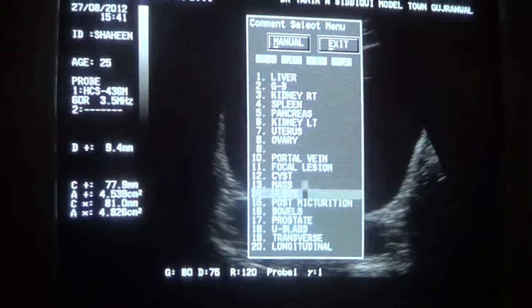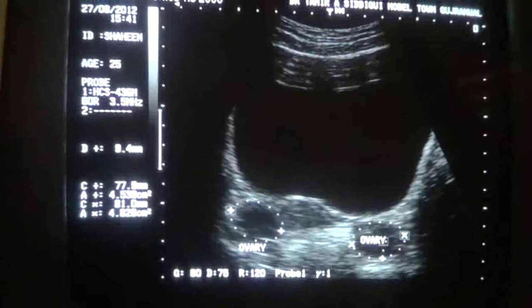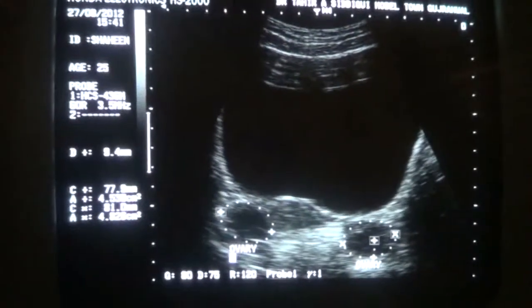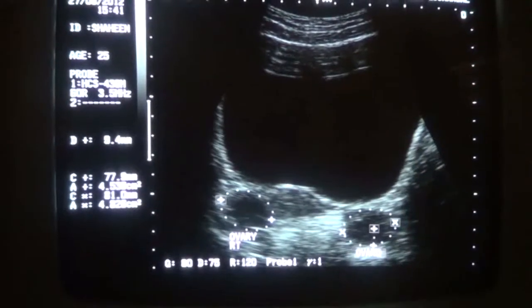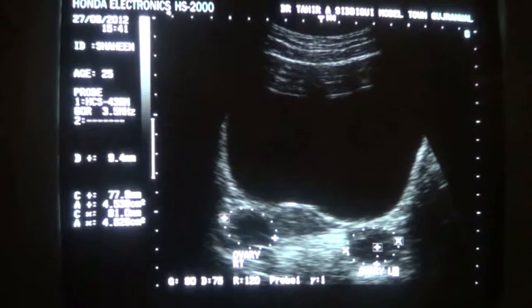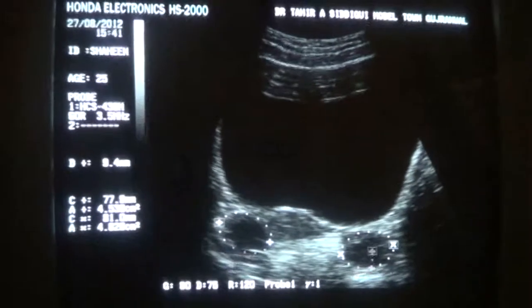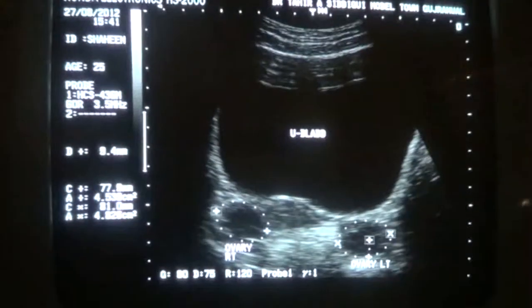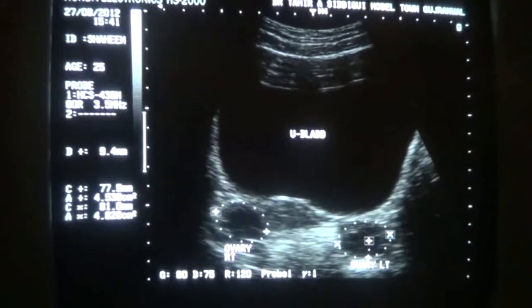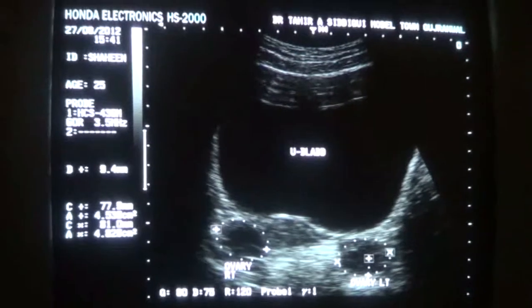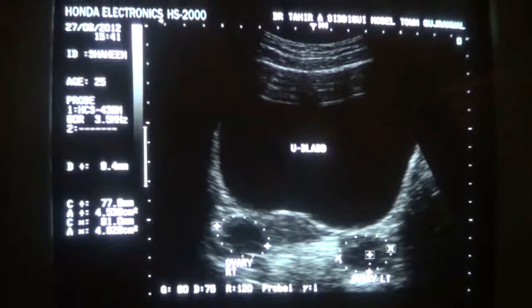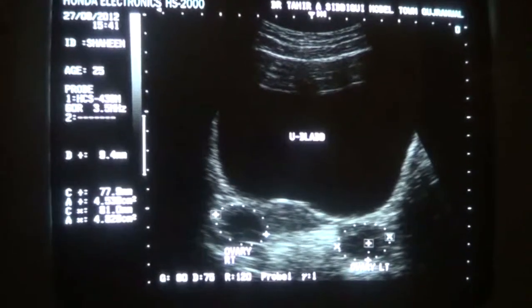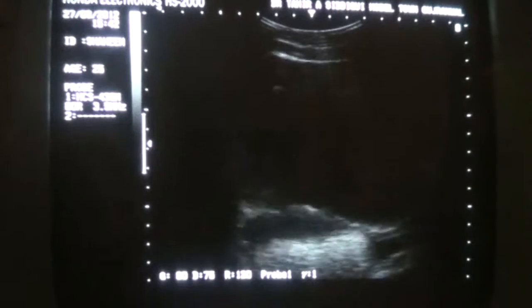This is the transverse section through a properly filled, adequately filled bladder of a 25-year-old married female who has not conceived and has been sent to rule out any pathology. At least the ovaries are normal and follicle activity is present. There is no focal mass or lesion at the level of the ovaries, and there is no fluid seen in this region.